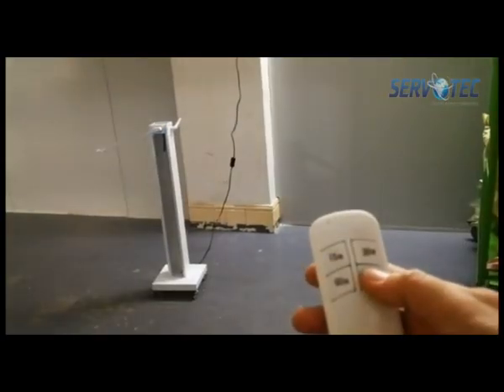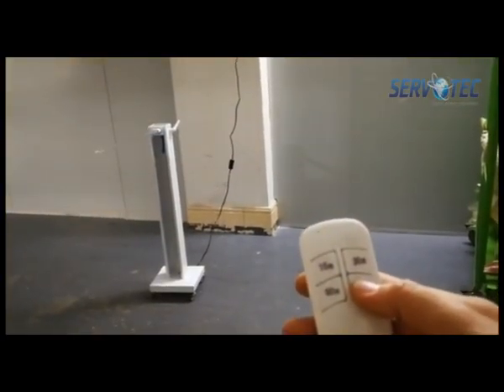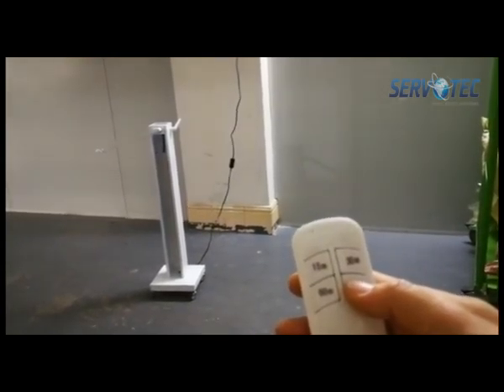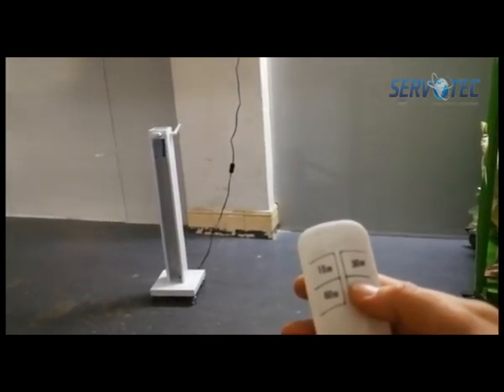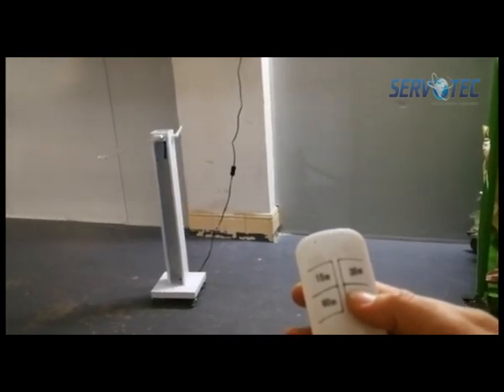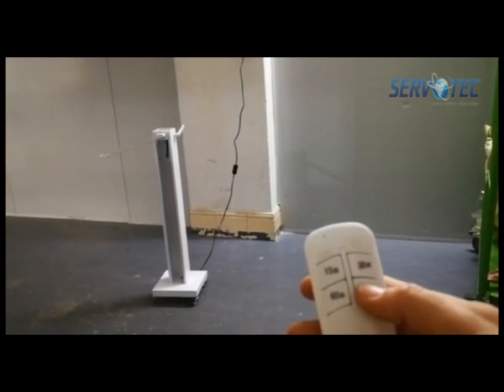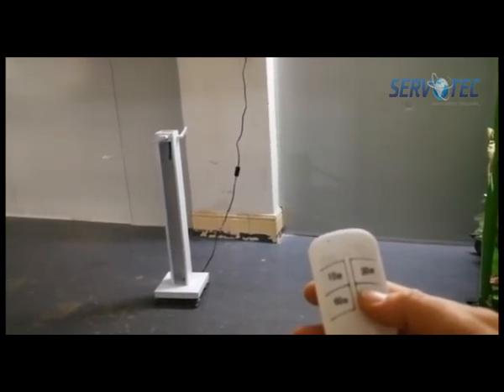Then move the equipment to the disinfection site, open the upper cover, and raise the lamp to the highest vertical position. Important note: do ensure the lamp body is in place.